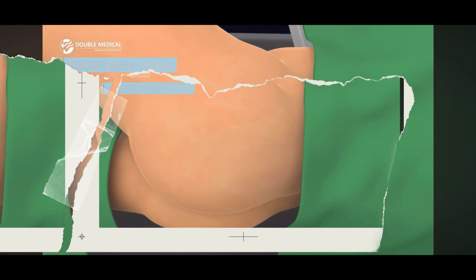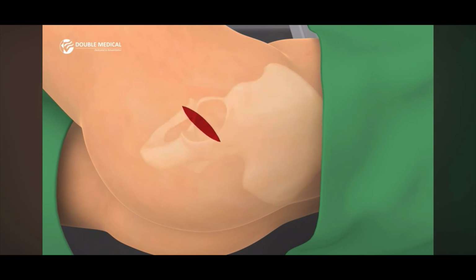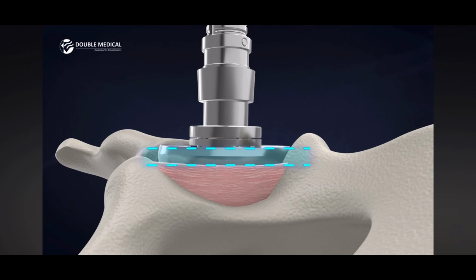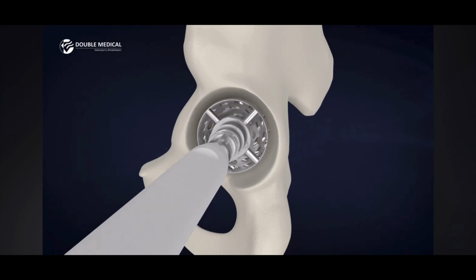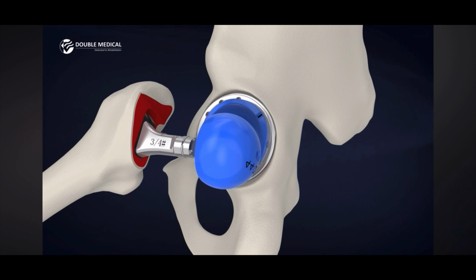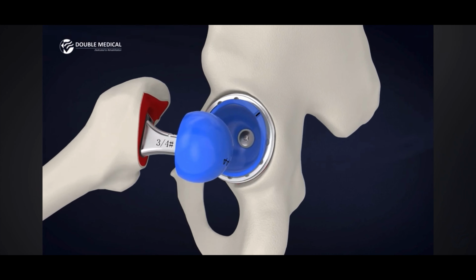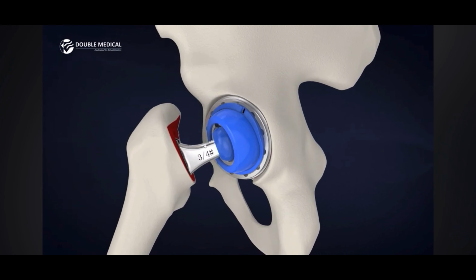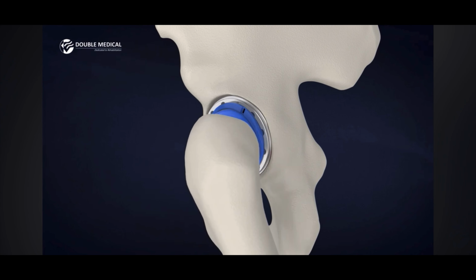In a total hip replacement, also called total hip arthroplasty, damaged bone and cartilage gets replaced with artificial components. It's a major surgery that is very safe, but it also can include risk of blood clots, hip dislocation, and infection. This makes it crucial for engineers to create products that are safe and biocompatible for the user.